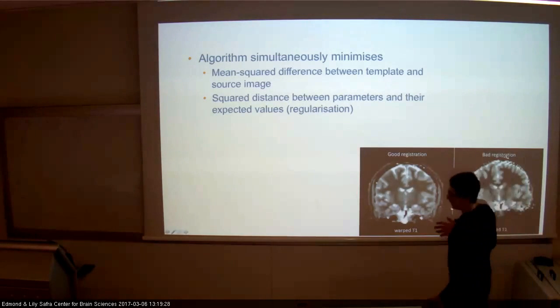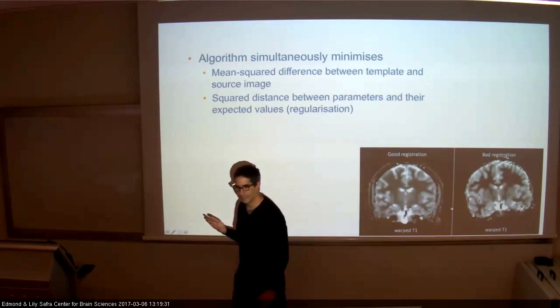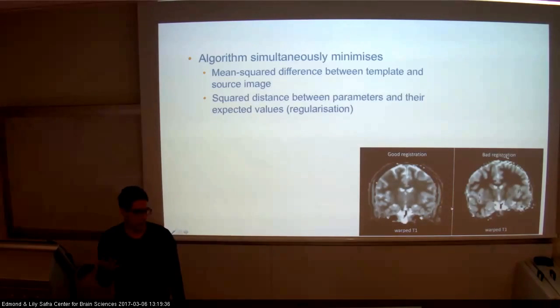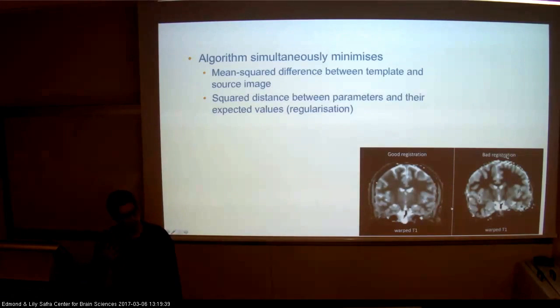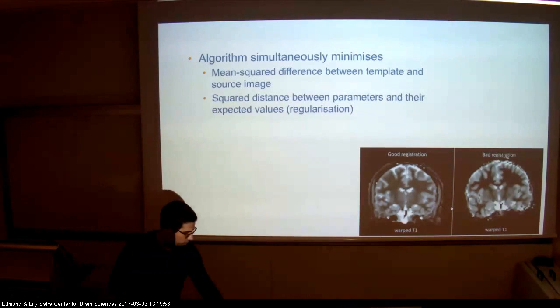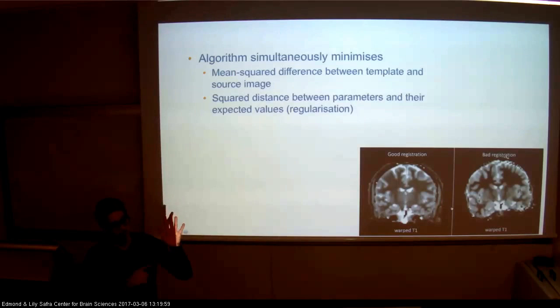Okay, so in the same brain, let's say I measure the same subject many times. In fMRI we do that. And he might move. We always move in the scanner. We're breathing, and by that we move. So I need to register 2 images. I don't think there is any crazy affine. The measurement wasn't stretched, and I was sampling k-space the same, so I don't expect any manipulation, just movement. I have one image with some gray level in each location, and another image which has almost the same gray level values, but shifted in space.